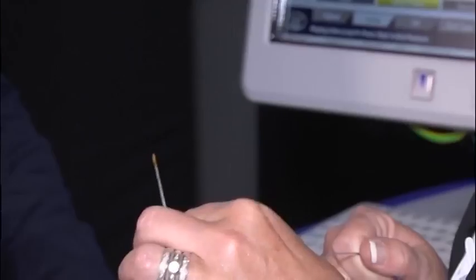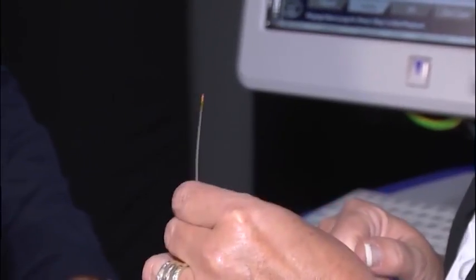Then you had another interesting item here with 64 cameras on the tip, is that right? Yes, 64 elements, which represent 64 cameras on the tip of the catheter, and you put this inside the artery to see what's going on inside it, because the artery is a 360 or 3D structure, and an angiogram is a luminogram, so it doesn't give you the 360 view.